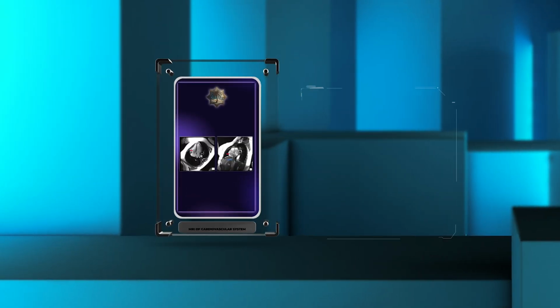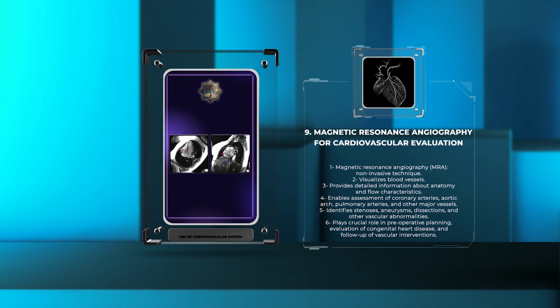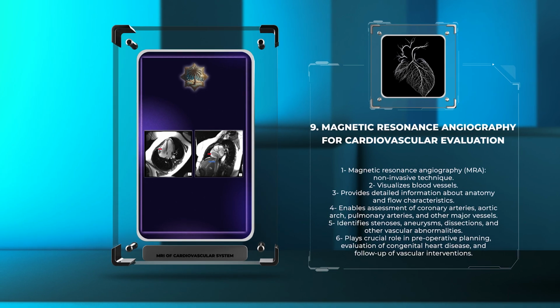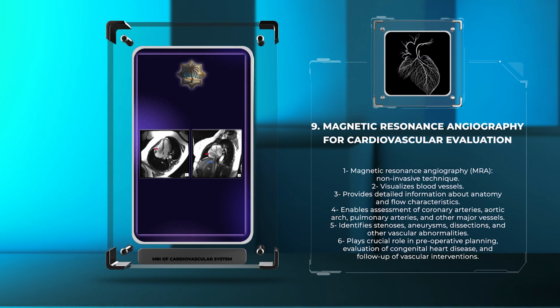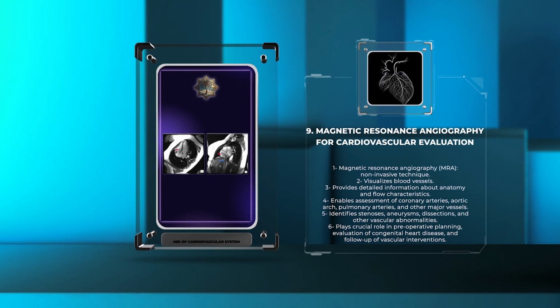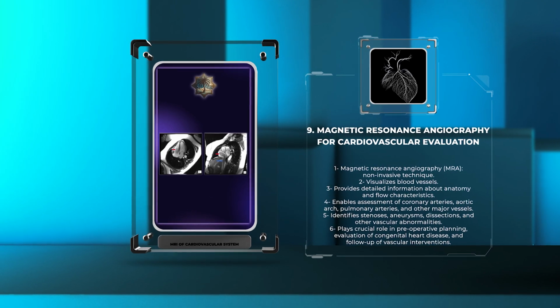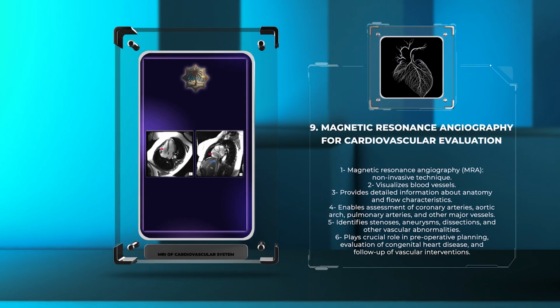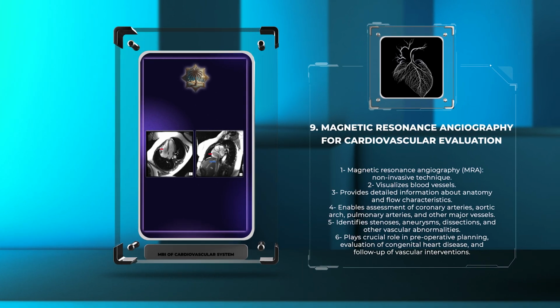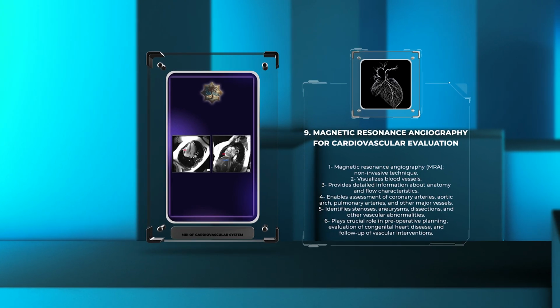Magnetic resonance angiography, MRA, is a non-invasive technique that visualizes blood vessels and provides detailed information about their anatomy and flow characteristics. In cardiac MRI, MRA enables the assessment of the coronary arteries, aortic arch, pulmonary arteries, and other major vessels. By using specialized imaging sequences and contrast agents, MRA can identify stenosis, aneurysms, dissections, and other vascular abnormalities. It plays a crucial role in preoperative planning for cardiac surgery, evaluation of congenital heart disease, and follow-up of vascular interventions.